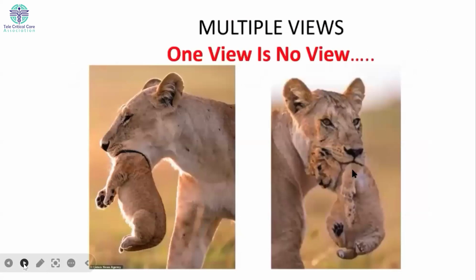Right. Lastly, multiple views. You should always try to acquire multiple views. One view is no view. With one view, you can sometimes diagnose falsely. So when you want to confirm your diagnosis, always try to get another view as well.